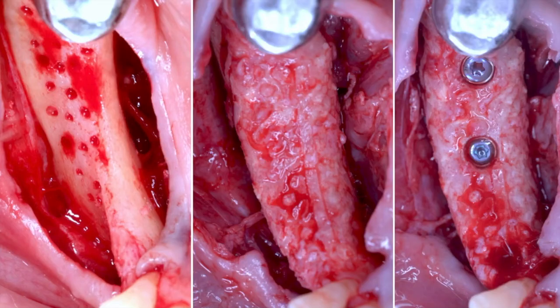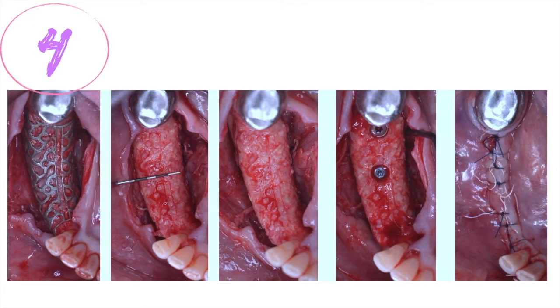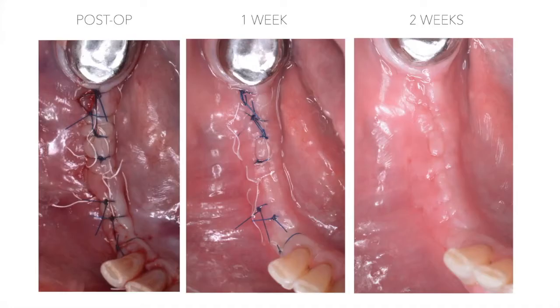A comparison shows the preoperative status, the intraoperative state, and the final implant placement. Three implants are placed for the final prosthetic phase. The step-by-step procedure includes membrane removal, implant placement, and suturing of the surgical site.